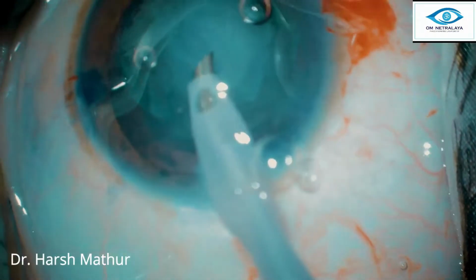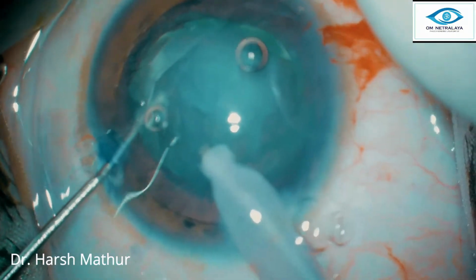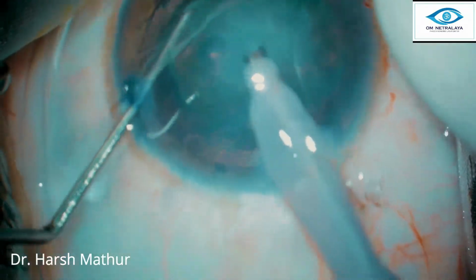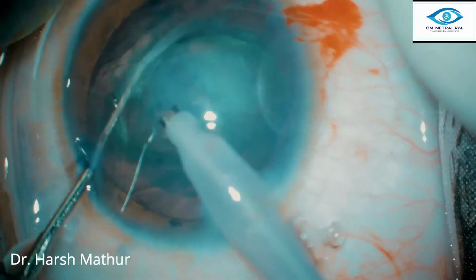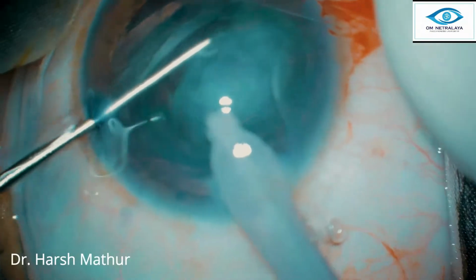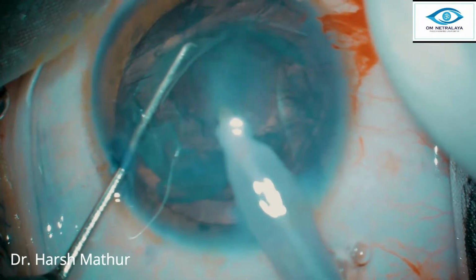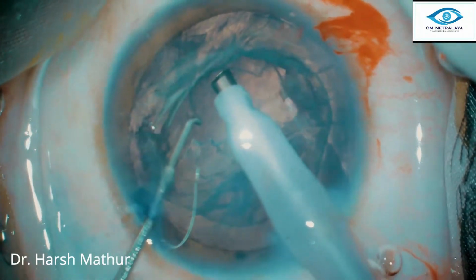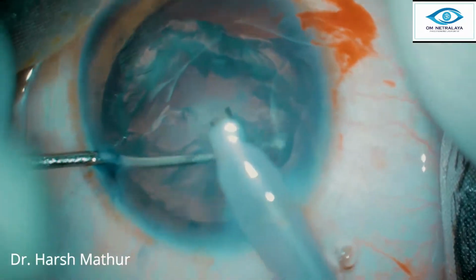Most of this nucleus is emulsified by gentle vacuum controlled by the foot pedal, and a moment of phaco energy is given when the hard part of it comes to the tip, and in no time we are able to emulsify the nucleus. So as we are working in the central safe zone, the endothelium is safe, the posterior capsule is safe, and this method is repeatable.